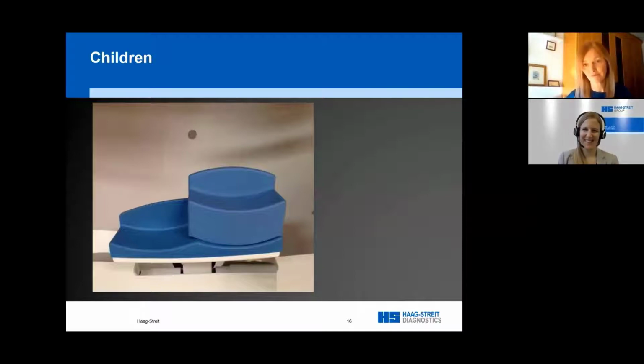There are definitely some practical elements though as well. From a very practical point of view, I think the primary one is position on the perimeter. You do need to build up the chin rest, and there is a specific adaptation you can order for this. That's shown quite clearly on this slide. You can see the build up chin rest. But in addition, it's just getting them into position first so they can kneel on a chair, or they can sit on the parent's knee, just to get that correct height position as well. You don't want them straining to have their chin on that chin rest.